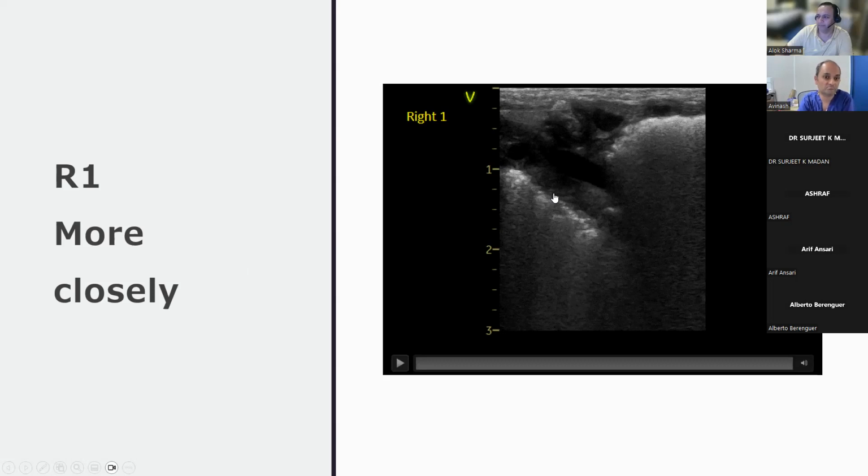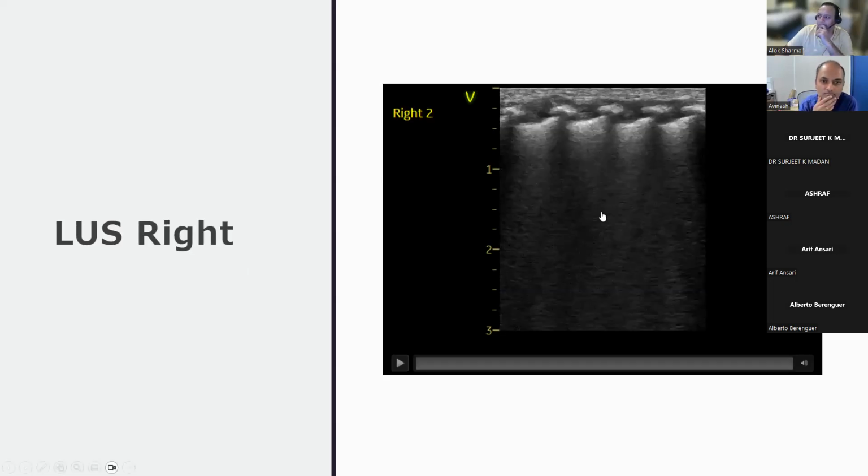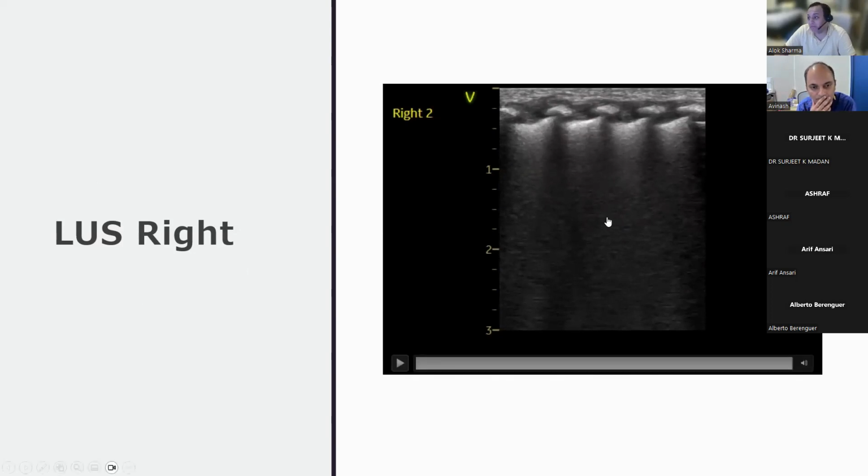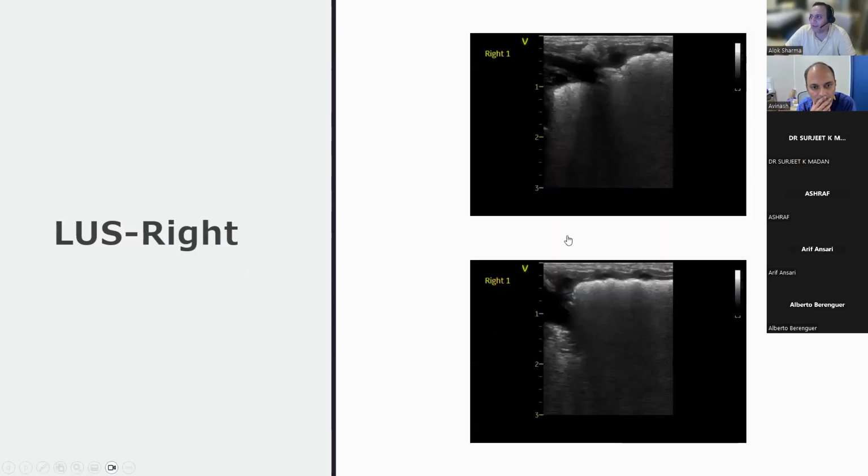And it appears like again either RDS or, it's a very homogeneous appearance, like evolving lung disease. Yeah. And if I said that this is what we saw in R3, R4, pretty much the back of the lungs is just completely white. So it's a very whiteout kind of lung, very homogeneous. There's no evidence of pulmonary hemorrhage. So other than this area of focal consolidation with a little bit of atelectasis in that right upper lobe in a baby who's acutely desaturating, what pathologies have we excluded? Is there evidence of a pneumothorax?